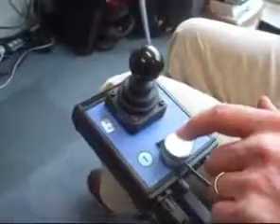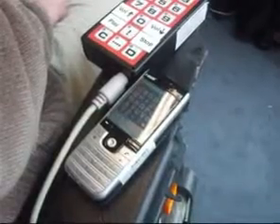The mobile phone option is selected on the Gini joystick display, which is the symbol T. The joystick will now control the mobile phone. The mobile phone is a smartphone with Click2Phone software installed. Here I have selected a contact on the phone, and I am sending a simple text message.